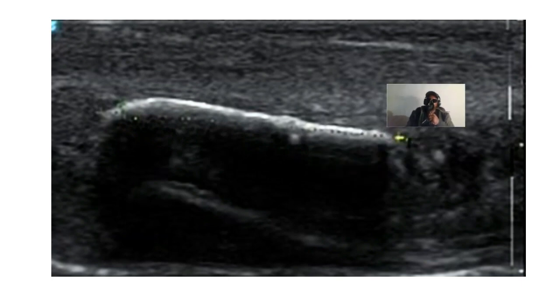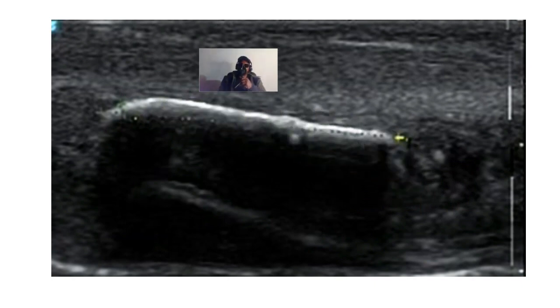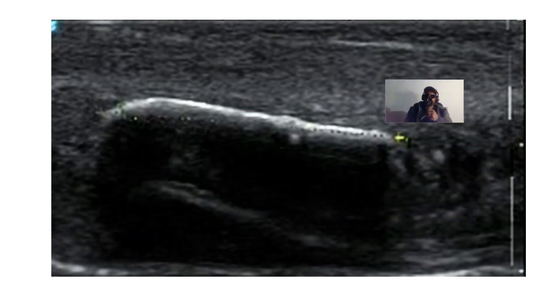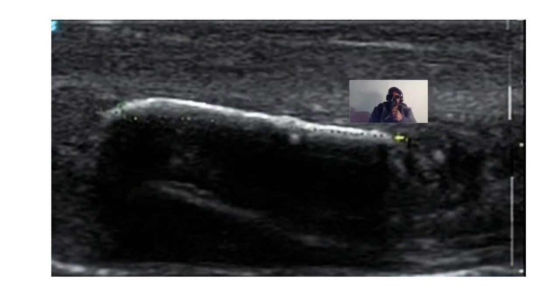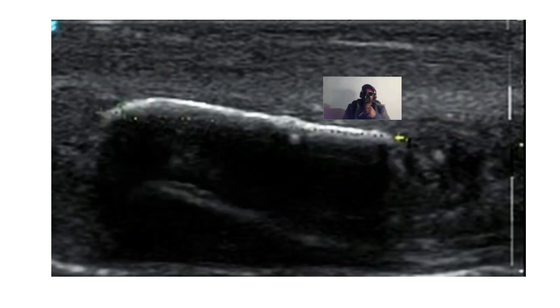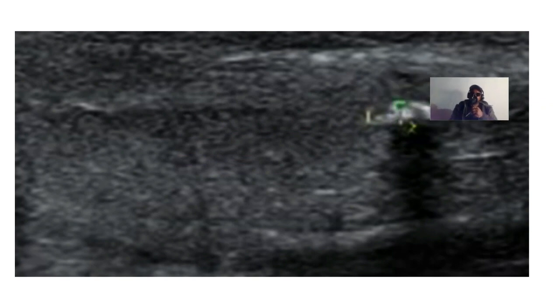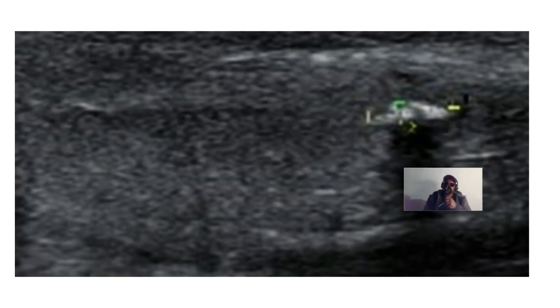The other thing that might also present likewise is a foreign body. So the history of the patient is pertinent for you to see if it's a calcification that is developing de novo in the penis, or is induced by trauma from a foreign body. So again, you can see another plaque there, calcification here in the substance of the penis with distal shadows like that.